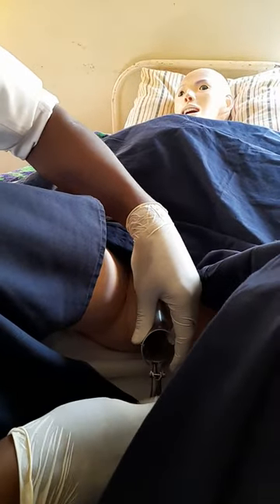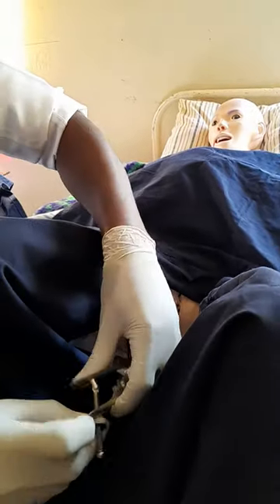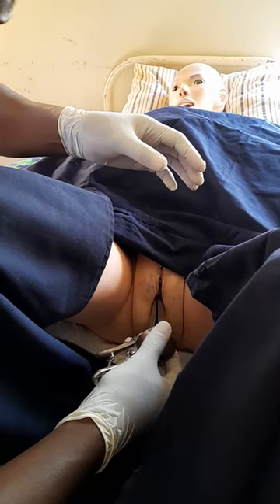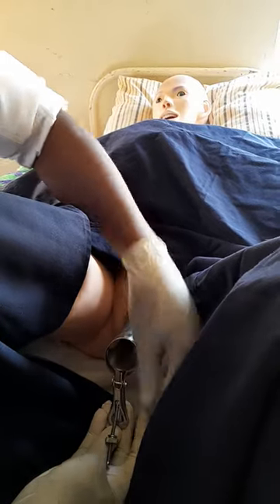To repeat the step: hold the speculum in the correct orientation, rotate it, insert it, then once inside the vagina rotate and open — this will reveal the cervix. The open speculum allows you to visualize where the cervix is.